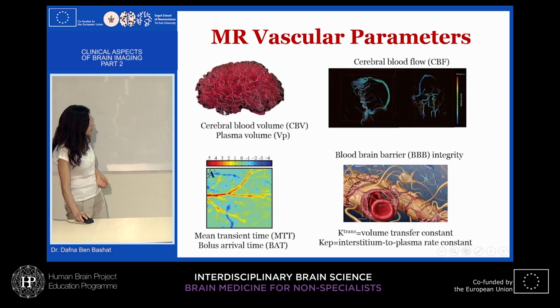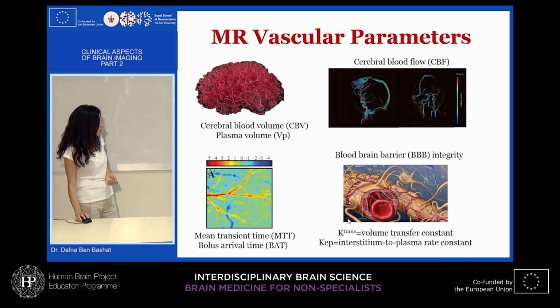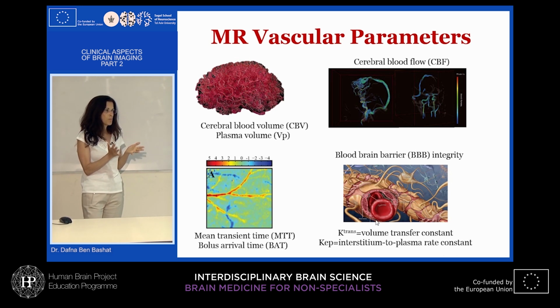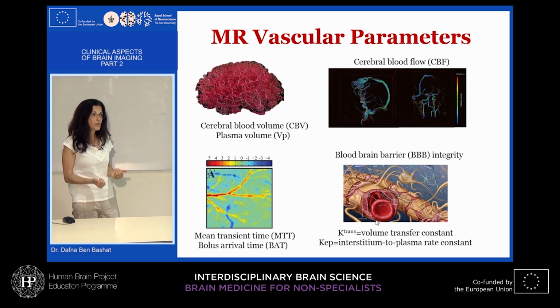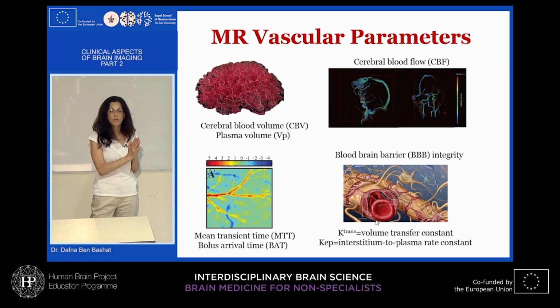And now we have a lot of pharmacokinetic models. We inject, we get dynamic images, and then we can quantify various parameters, it doesn't matter, K-trans, Kep, that really quantify this impaired permeability. Even in Alzheimer's, we know that there are specific areas within the brain that have very slight impaired permeability.